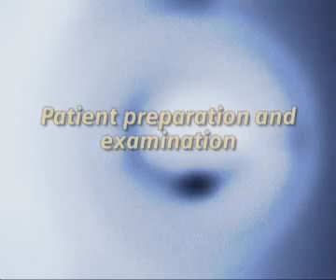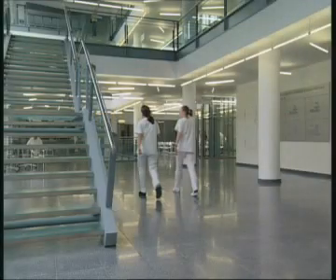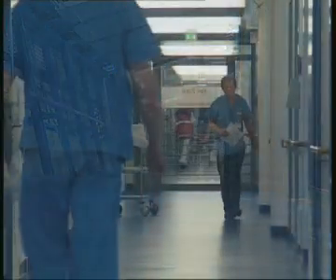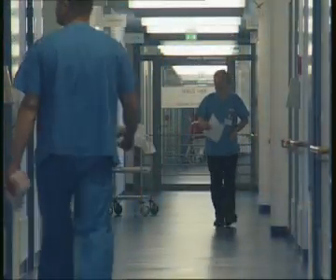Patient preparation and examination. Each MR unit should provide careful patient information in order to avoid surprises during the examination and to prevent risks for patients with contraindications. Patients entering the magnet room must be thoroughly checked and must fill out a screening form prior to an MR exam.